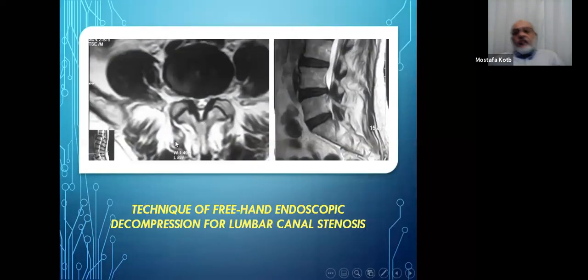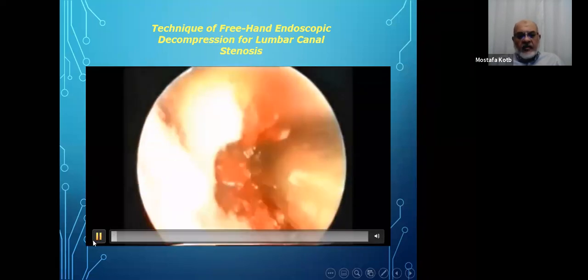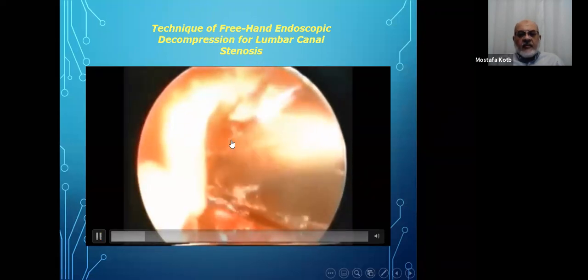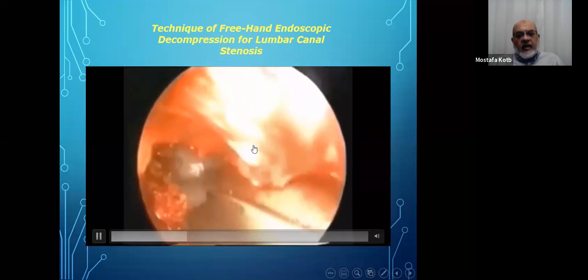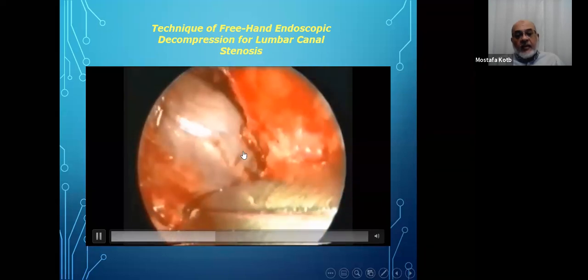As for the cases of spinal canal stenosis, segmental spinal canal stenosis like this one, I developed also a technique to operate on these cases. I go by the same approach as for the discectomy, but here after opening the ligamentum flavum, I start by going medially, taking out the ligamentum flavum until I reach the contralateral side of the theca and expose the nerve root on the other side by tilting my endoscope.